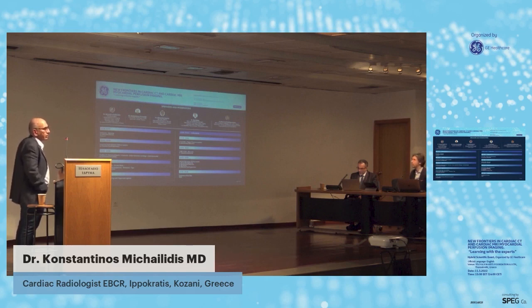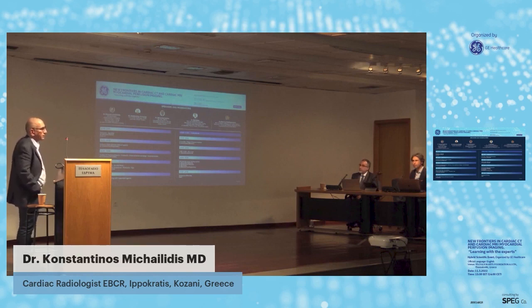So CT offers a lot, and in people with very bad family history and people with diabetes mellitus, calcium score a lot of times is not enough. For this group, the diabetes mellitus group and family history group, I think CTCA has to be done. We cannot rely on calcium score alone. Even a calcium score of 0 doesn't say a lot.